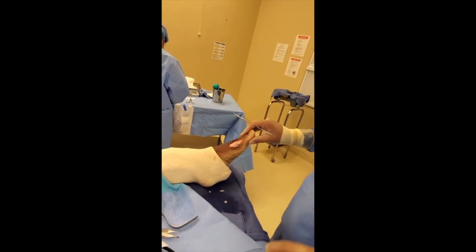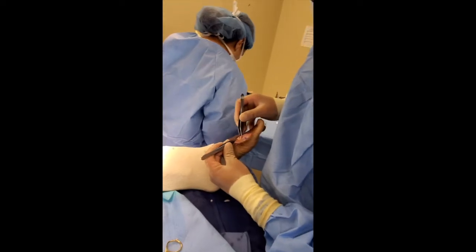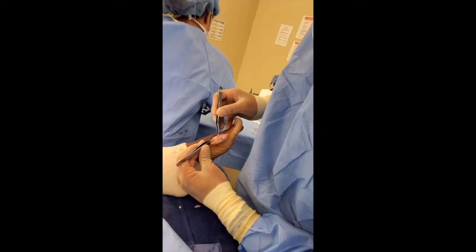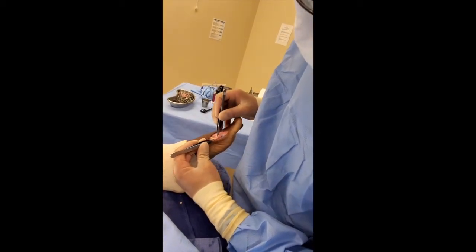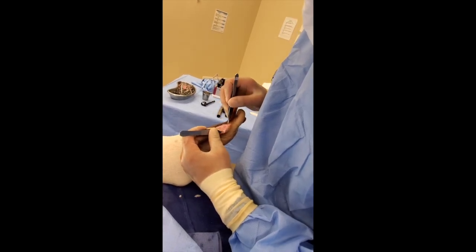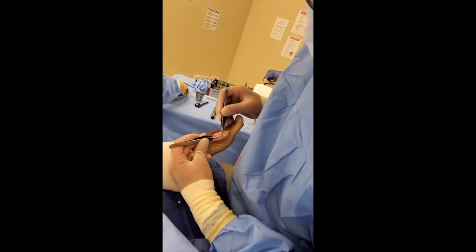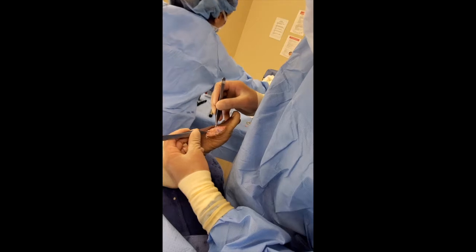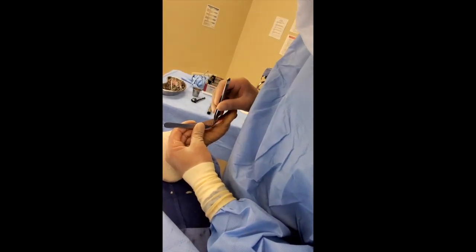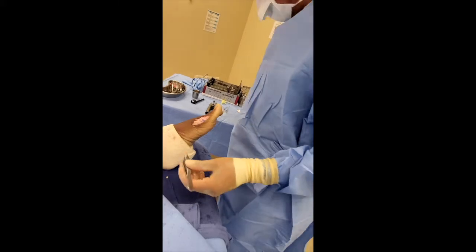It's ready to be sewn up, and when the numbness wears off the best thing is there's going to be no pain. This is the subcutaneous layer — it's well preserved. There's a nerve that runs right along the medial marginal vein there. If you flip the subcutaneous layer over you can see we've sewn up the deep fascia very nicely — all the way across this way and then vertically from way down there all the way back up. You can see the final knots right there. This tissue is going to lay right across, and once I bring this skin up and this skin down, we'll cover the whole thing.